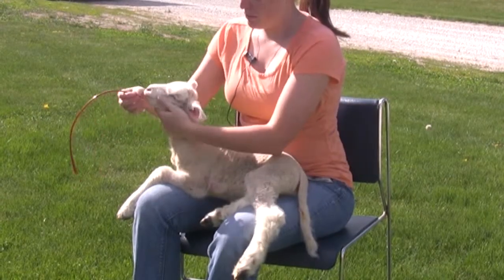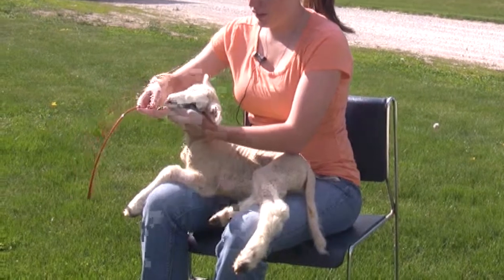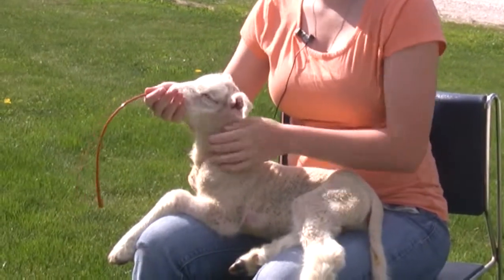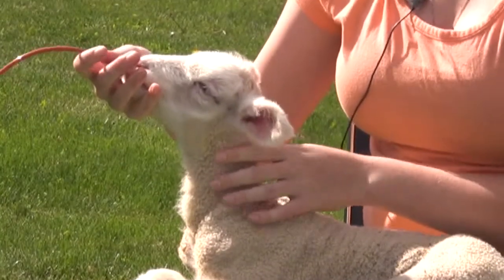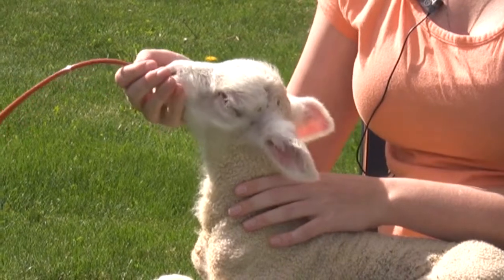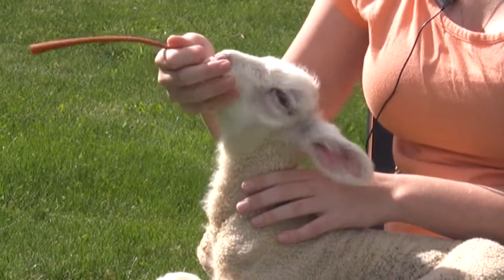Begin with the tube unattached to the syringe and insert it gently into the lamb's mouth and slowly ease it towards the back of the mouth. You should not have to apply much pressure, as the lamb should naturally swallow it. If the lamb is chewing on the tube, it is swallowing it. Take your time and be gentle.